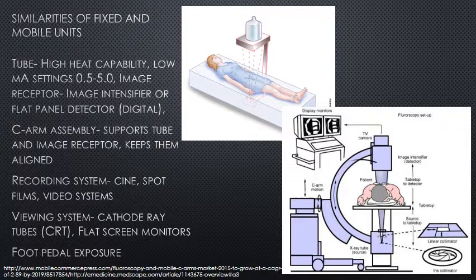So typically on regular diagnostic units we use MAs in the 50 to 1,000 or 1,200 MA range. Early in fluoroscopy use, you couldn't record any dynamic imaging, but now with video recording, you can look at those images again.